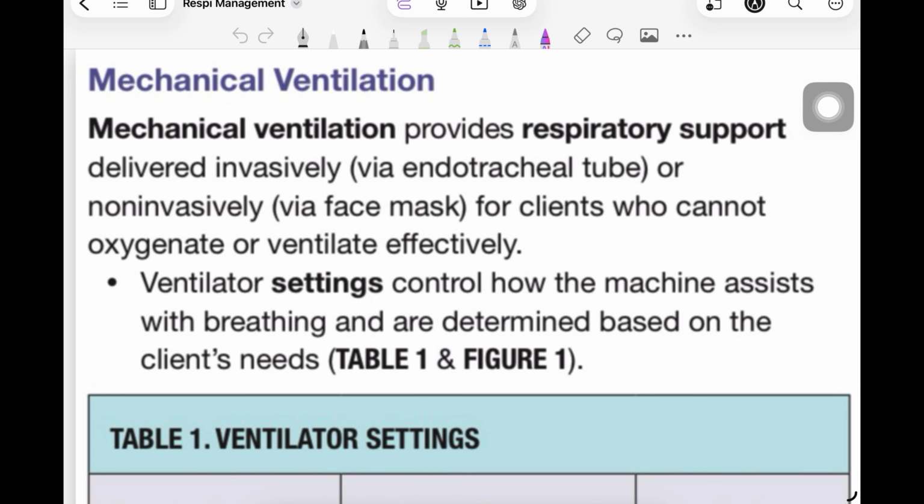So, bakit naman gagamit ang pasyente ng mechanical ventilator? Ano yung mga indications? Bakit kailangan gumamit niyan? Maybe yung pasyente, guys, nagre-require na ng support sa makina kasi hindi na kaya ng pasyente to breathe on their own. These are the indications: respiratory failure, severe pneumonia, or nag-exacerbate ang kanilang COPD. Ano pa yung na-discuss natin? Kapag meron silang ARDS. Yun yung mga mostly pasyente na gumagamit ng mechanical ventilator.